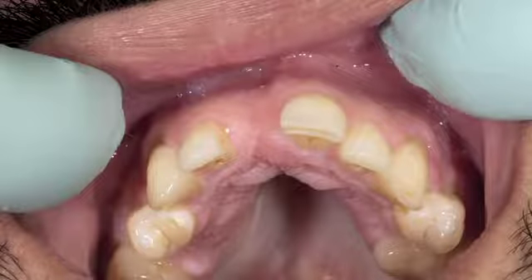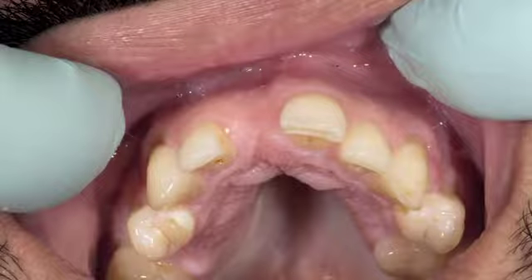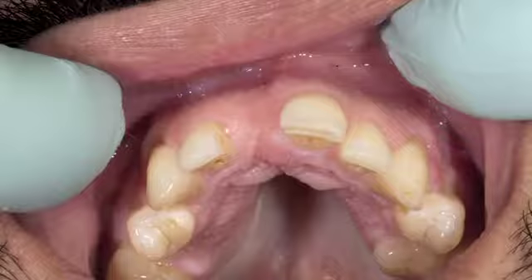One of the challenges that we faced with this patient was the fact that he has been living without tooth number 8 for a considerable amount of time, which has caused some blunting of the papilla between 7 and 8 and 8 and 9, as well as a moderate buccal defect, as you can see there.